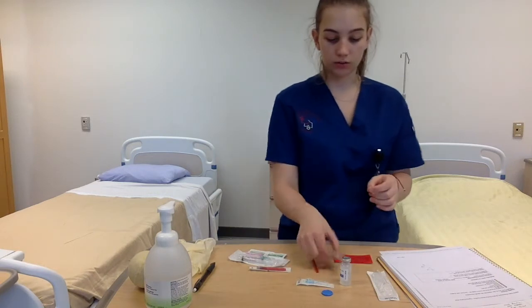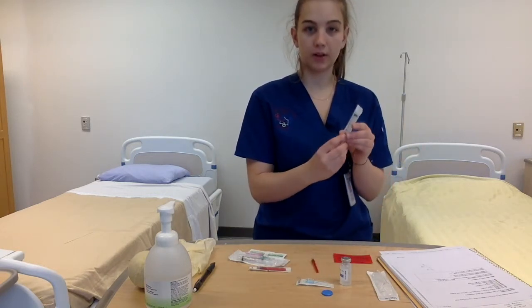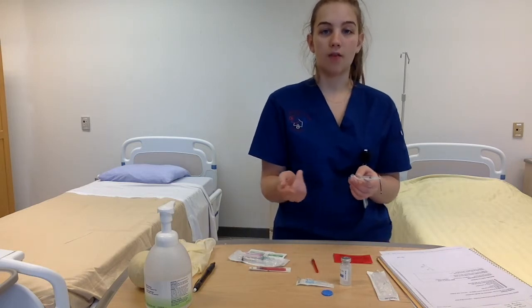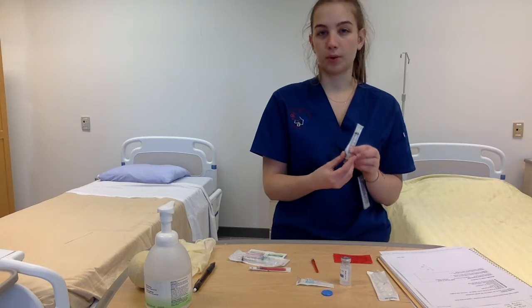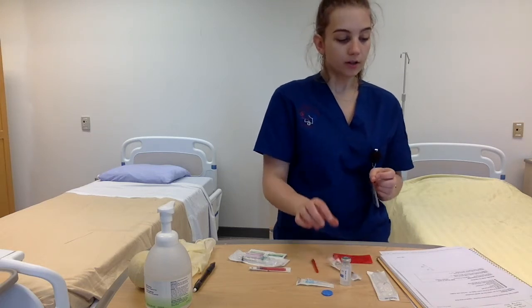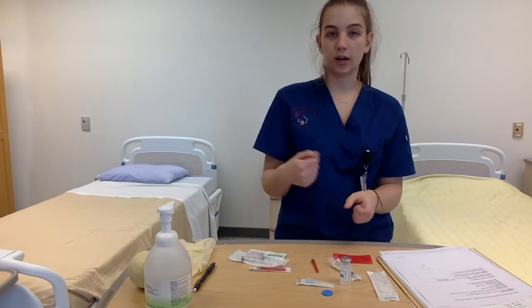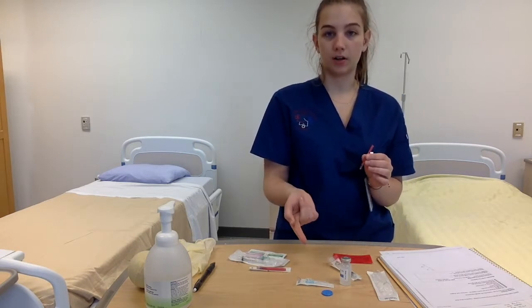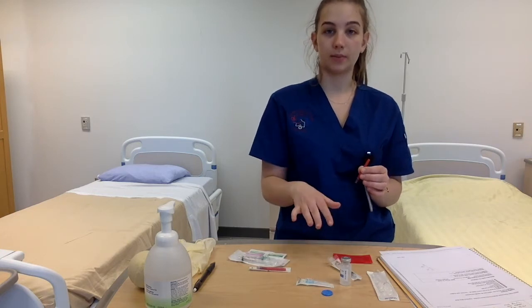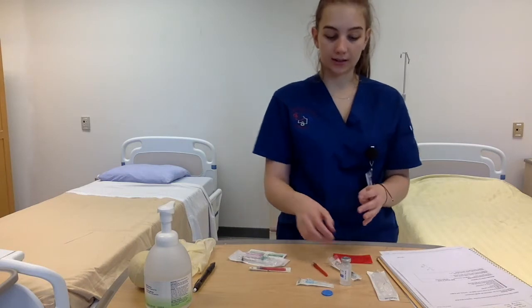And I've also chosen a syringe that goes up to 3 milliliters, since the correct dose of Mr. Mancini's medication is going to be 1 milliliter. This is an appropriate syringe to use. So first I'm just going to start by drawing up the medication using a blunt tip needle, so that the other needle that we're going to be injecting into the patient doesn't get damaged while we're drawing up the medication. So I'm just going to get that set up.